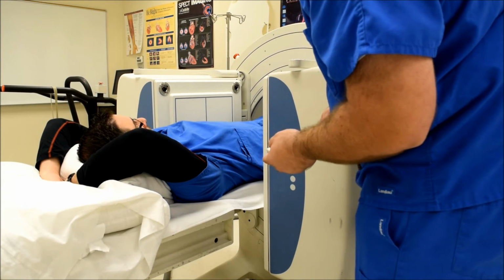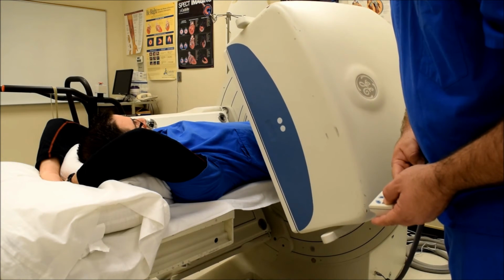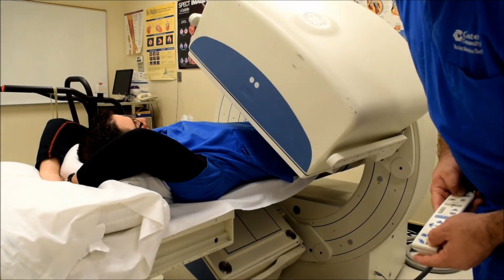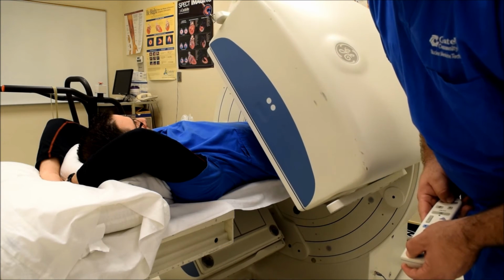Okay, go ahead and keep spinning it, make sure it clears everywhere all the way around them. Okay, looks good there. We're going to go back to our start position.